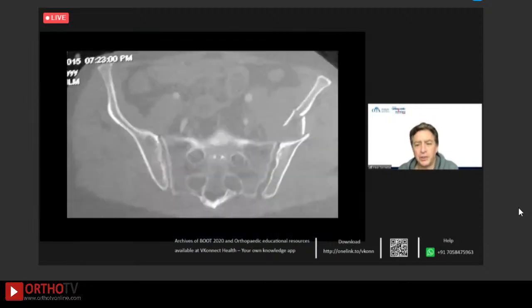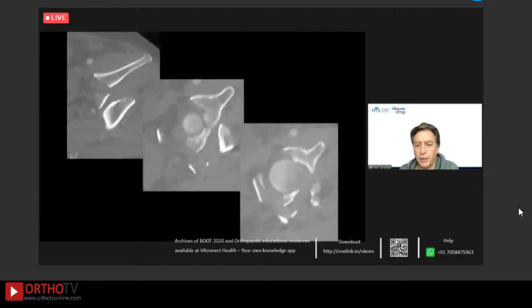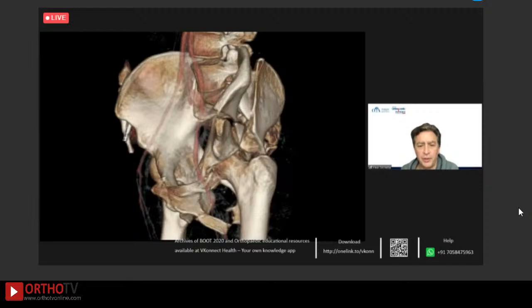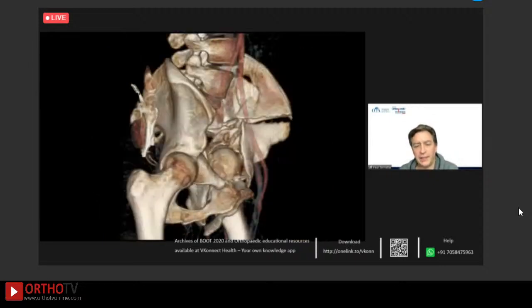So here's the CAT scan, just showing what we're talking about. The SI joints, thankfully, I thought were okay. That looked a little funny to me, but I wanted to evaluate it. And here you can see these separate fragments, separate roof fragment, separate posterior wall fragment, all of which are not large, with a tremendous amount of comminution. I think it's similar to the case, Dr. Tricca, you showed, but a little more intra-articular comminution. So here's the 3D to give you an idea of what we're dealing with. Now, she's 52. The other thing is a segmental posterior column, which makes things exceptionally difficult. And you can see that separate roof fragment through the fracture site there.